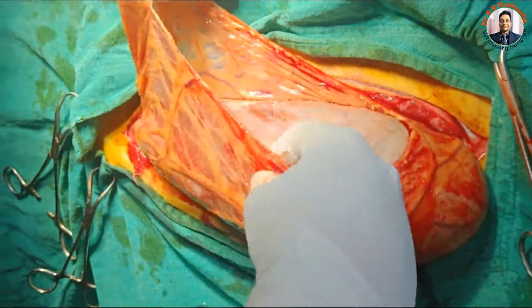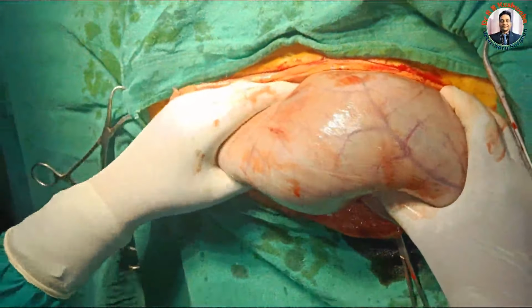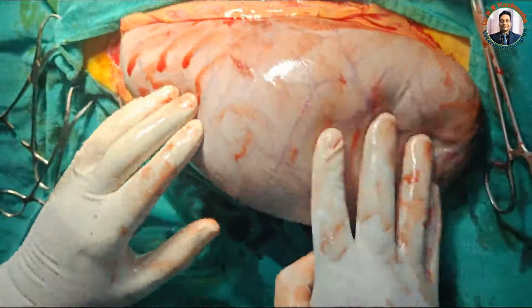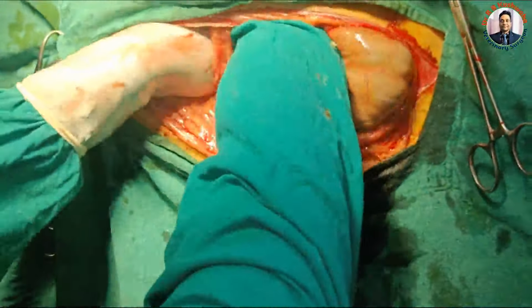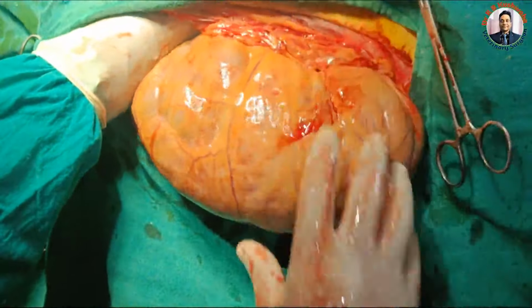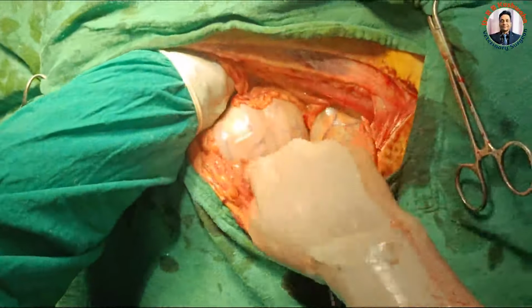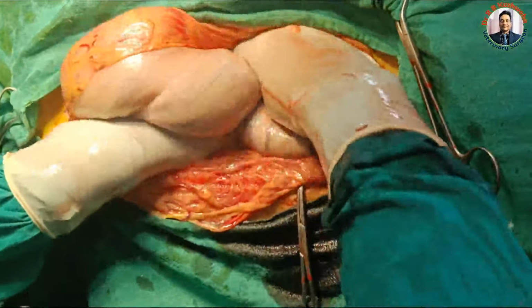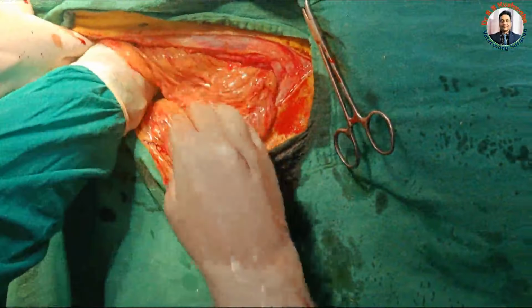This one is the external sheath of the omentum. This is the rumen. You should not confuse it with the uterus. The surgeon must be able to differentiate, by the branching of the blood supply, whether this is the rumen or the uterus. This is all intestine, it is coming out. And here we have to separate the omentum also.